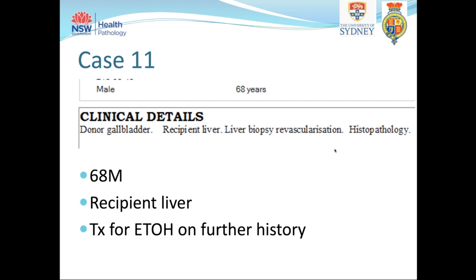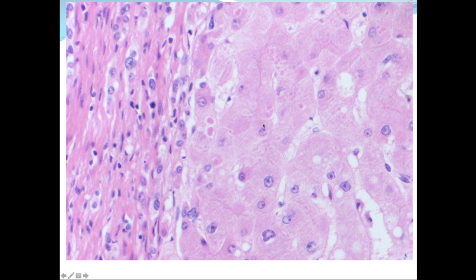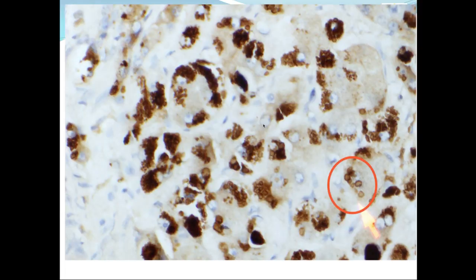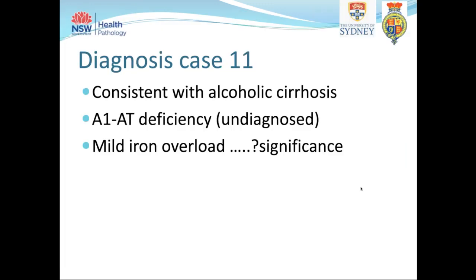And you can see on the H&E, in fact, that in addition to the other changes I described, there are a number of cytoplasmic globules present, which are clearly seen on DPAS, as well as alpha-1 antitrypsin immunohistochemistry. And they do show these rimmed vacuoles, which are very characteristic of alpha-1 antitrypsin. If that wasn't enough, there's also some iron in the liver. So we have changes consistent with alcoholic cirrhosis, which, as I said, can be tricky in end-stage liver, but I think we've got enough to corroborate this.